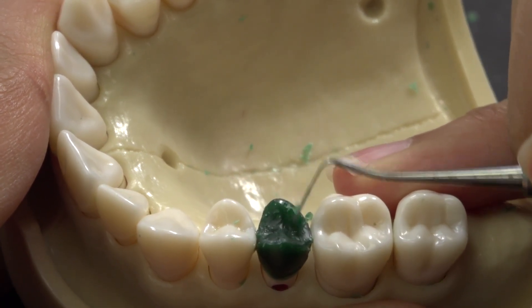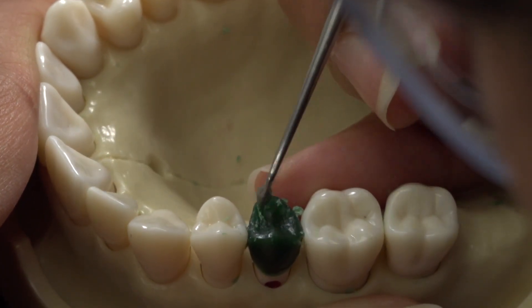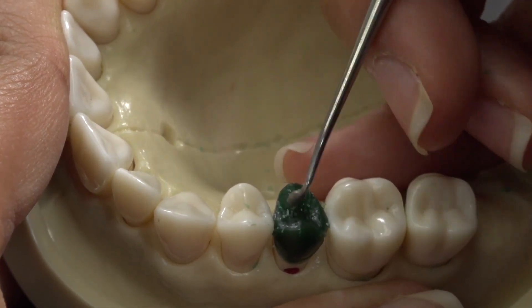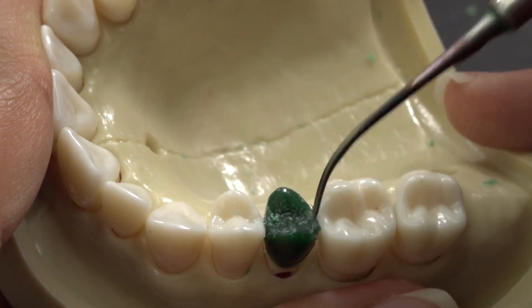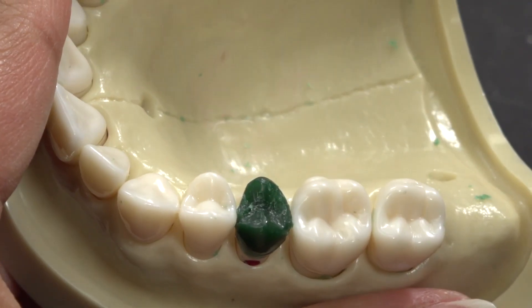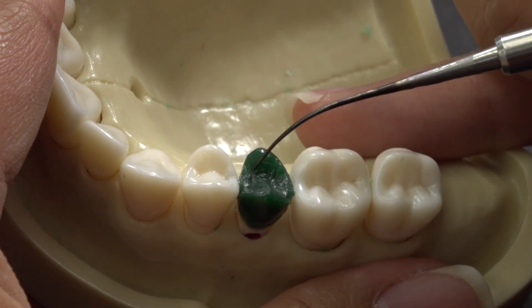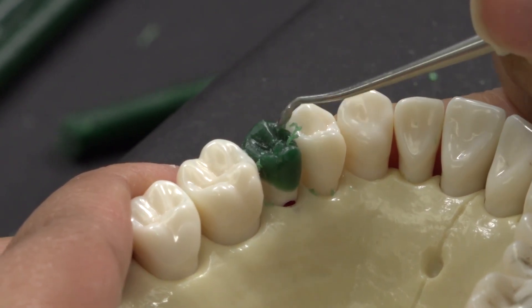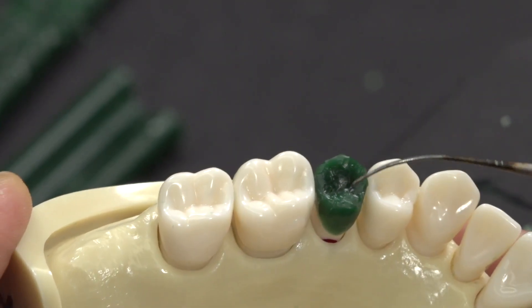Make sure the occlusal ridge is still pronounced and protruding out. Check the width of the occlusal and points of contact.